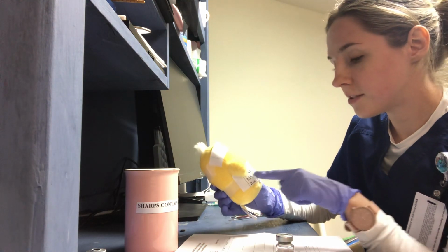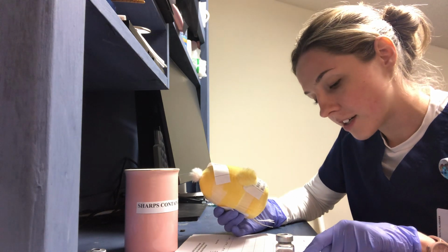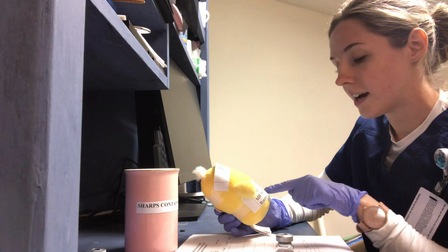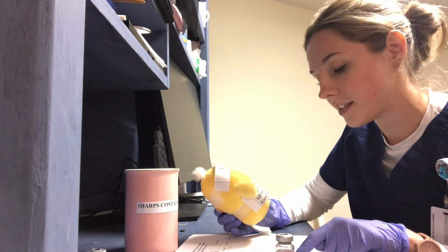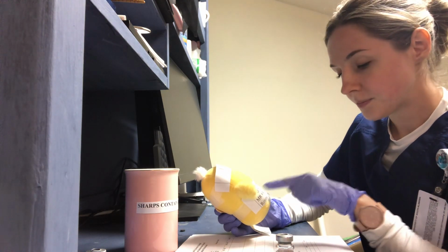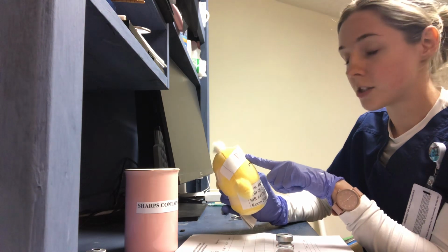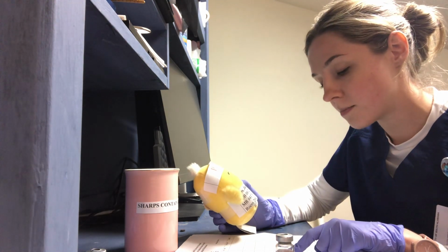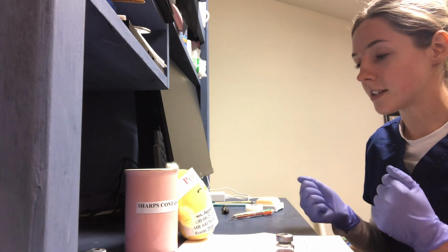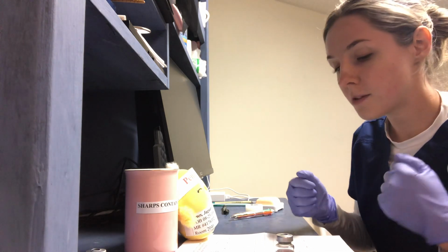Mr. Jaguar Jones, Jaguar Jones in the MAR, medical record number 417-6352, date of birth 8/25/1963. So we have the right patient. We already see his armband says he's allergic to penicillin. His allergies in the MAR say he's allergic to penicillin. Are you allergic to anything other than penicillin? I would ask the patient. So no, we're good to go.